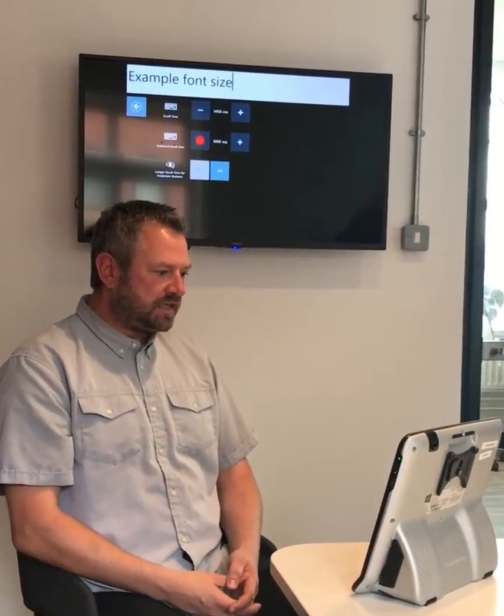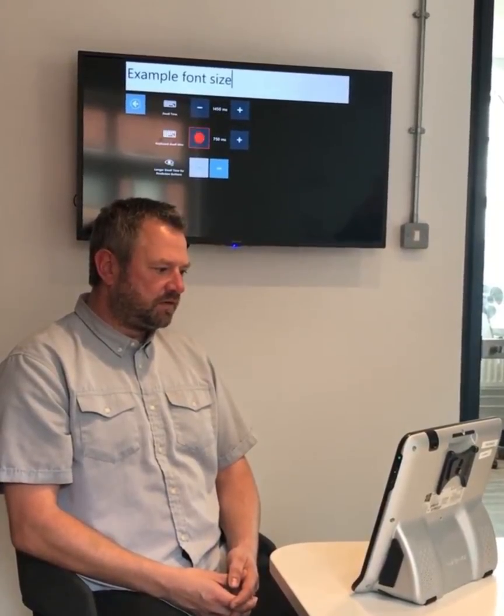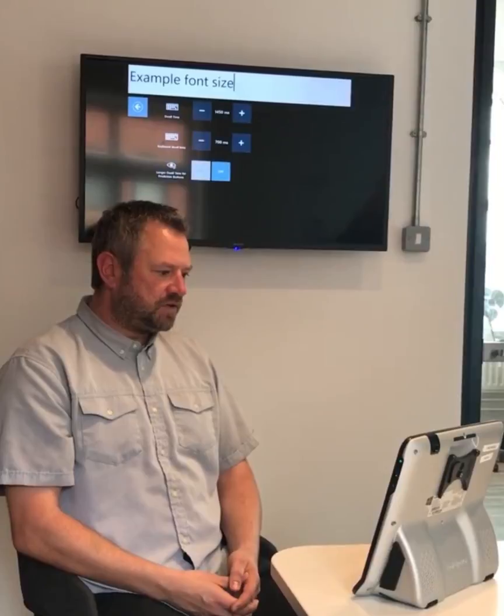Quicker, but still not quick enough for me. So what I'm going to do now, using my eyes, is take this down to something really quick — because I can type quite quickly and I know how to use a QWERTY keyboard. So I'm going to take that all the way down to 0.6 of a second — 600 milliseconds.